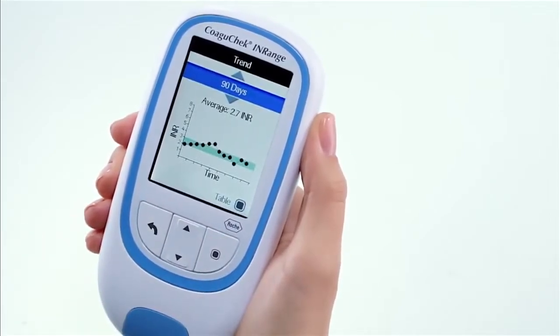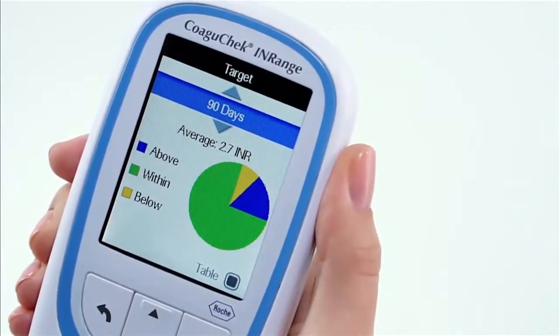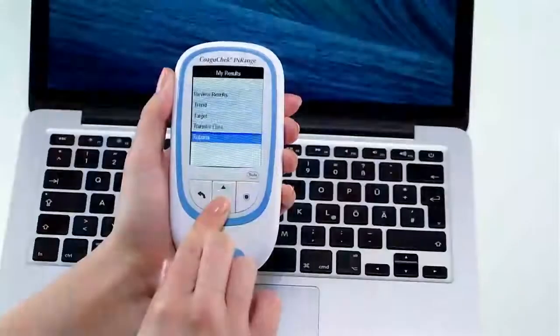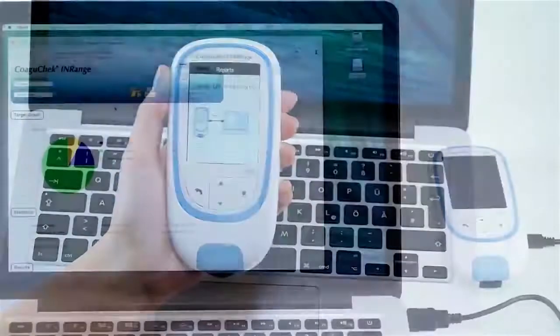The COAGUCHECK INRANGE allows you to check your time in range by graphically displaying how many times you have been within, above or below your target therapeutic range. You can review your results on a PC by connecting your device via USB cable. A USB cable is included in the box.